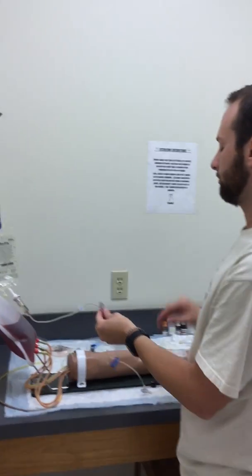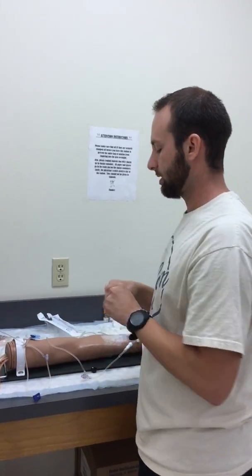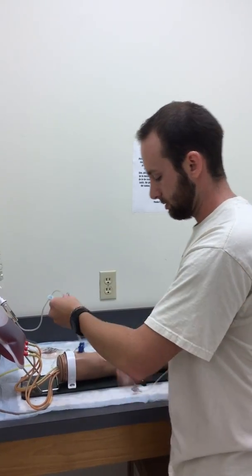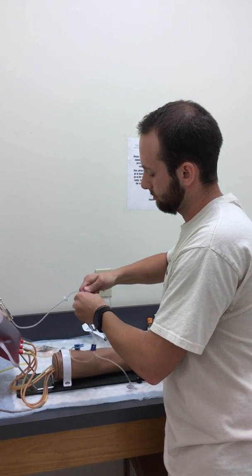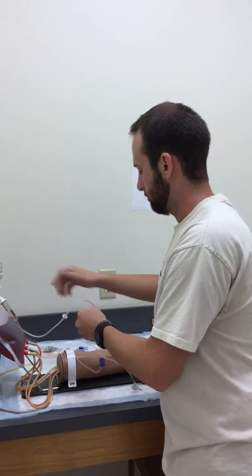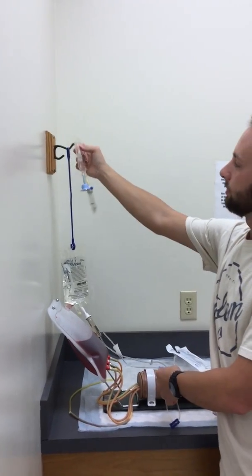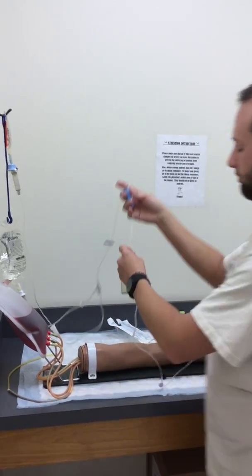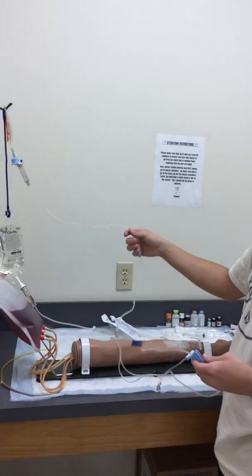We're going to want to have on gloves, wash your hands, of course. Then we're going to want to take an alcohol swab and clean our port that is closest to the primary bag that is being infused. Clean it. Okay. I want to make sure that this is plugged in. And we're going to hang our IVP bag above the primary bag. And we're going to want to control it with the primary tubing clamp. We don't control it with this one, we do it with this one.